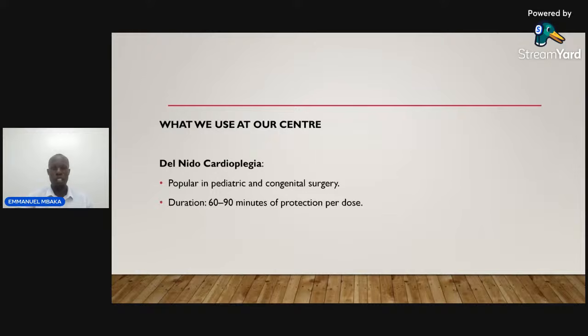So, what cardioplegia do we use? In our centers, we use del Nido cardioplegia because it's popular in pediatrics and congenital surgery. The duration of del Nido is around 60 to 90 minutes of protection per dose. Next slide.